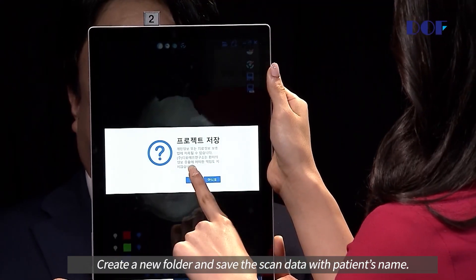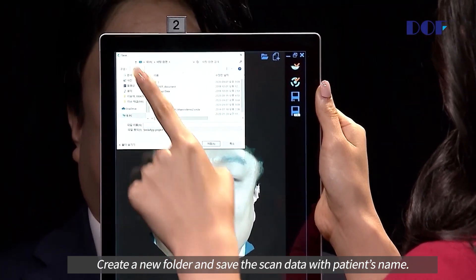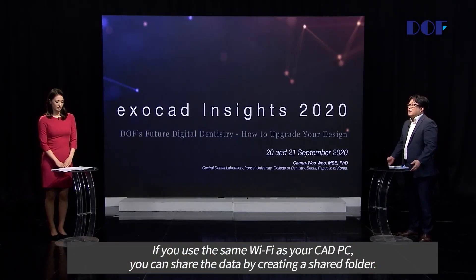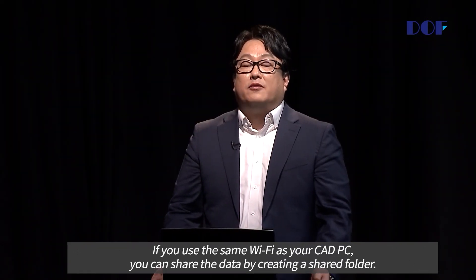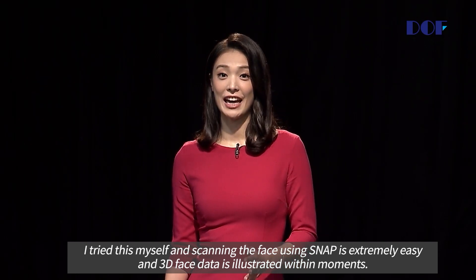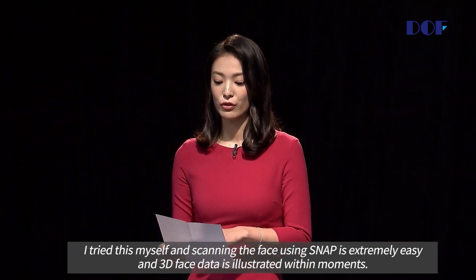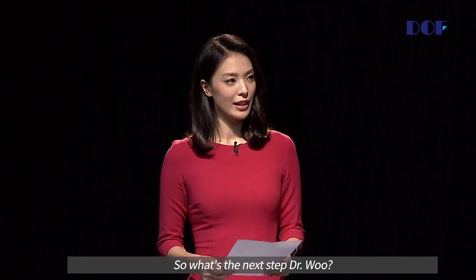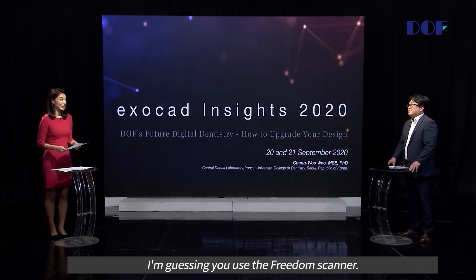The next step is scanning the target with the upper bite fixed. When the target is scanned at the appropriate location, it will automatically complete. Create a new folder and save the scan data with the patient name. If you use the same Wi-Fi as your CAD PC, you can share the data by creating a shared folder. I tried this myself, and scanning the face using Snap is extremely easy — 3D face data is illustrated within moments.